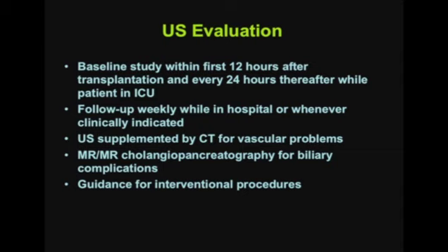If a vascular problem is suspected, we will supplement the ultrasound examination with CT angiography. MRI and MR cholangiopancreatography are generally reserved for biliary complications, and we use ultrasound as a guidance tool for interventional procedures.